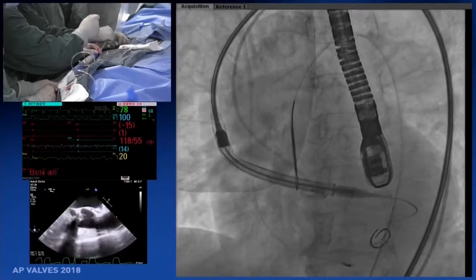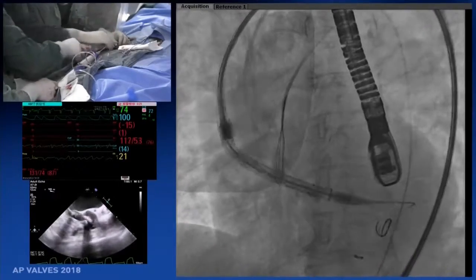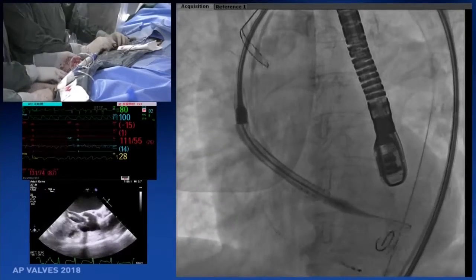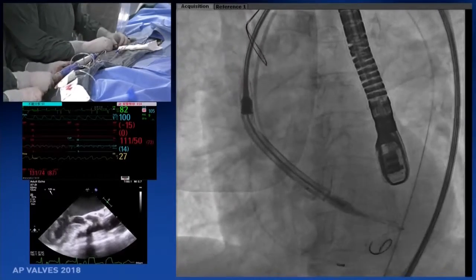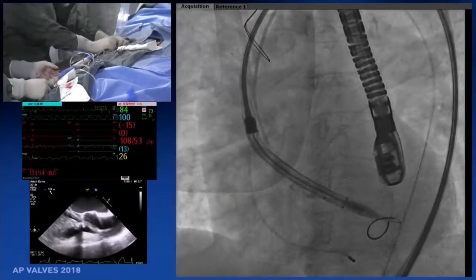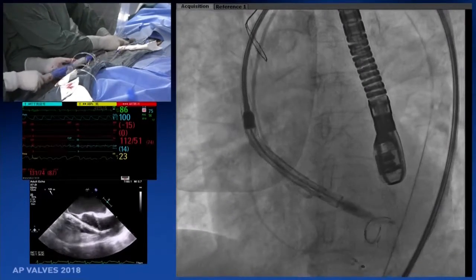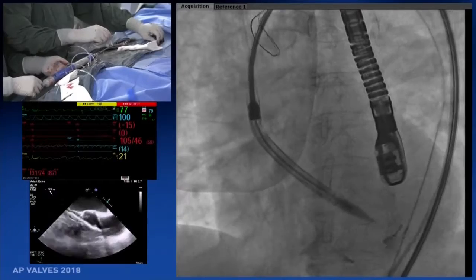Looks like a snake. Is the pigtail still in the aorta? Oh, of course not. Maybe yes. Not sure. So why is it very difficult to cross the aortic valve with this device? Stiffness? It's more stiff, yeah. Much more stiff. I don't think so. Okay, now you're in. So the initial deployment cannot be too high. Too high is where we jump out. Is the pigtail still okay? Oops.